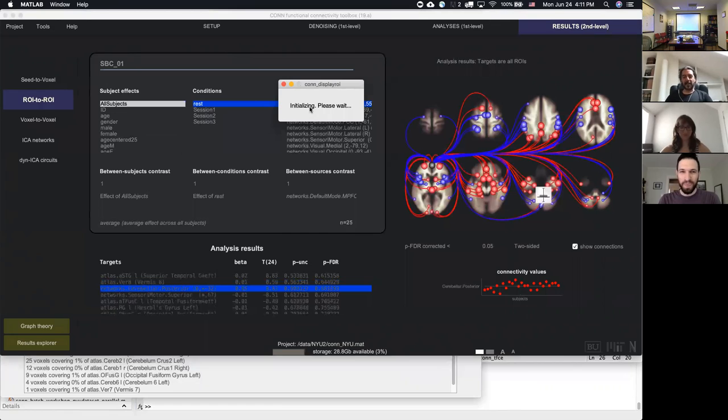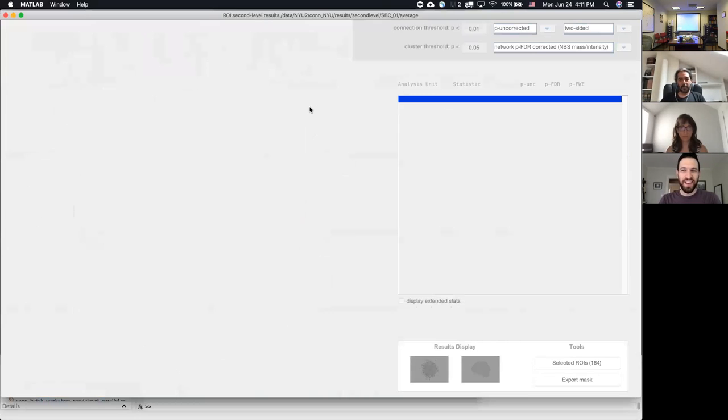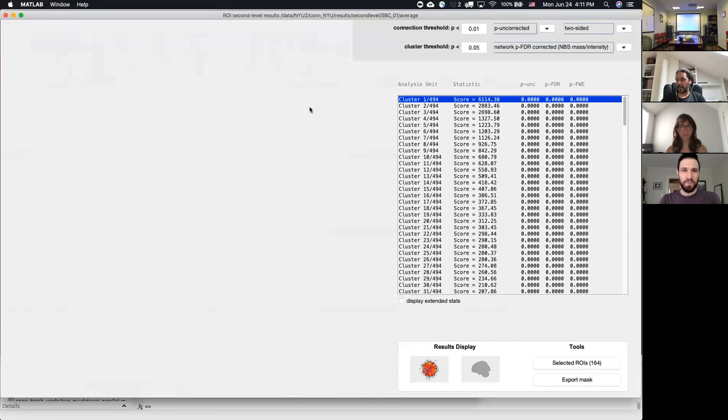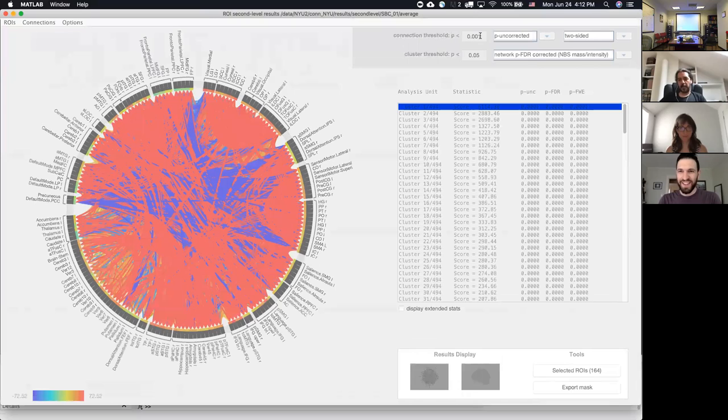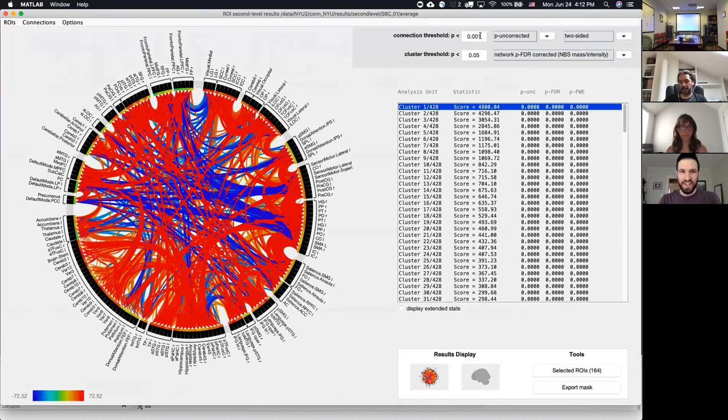Right. Now, this is only because I've been playing with the randomization procedure, whether to square values or not, because I was working with threshold-free cluster enhancement. That has one particular, pretty cool way of combining the extent and the strength of the results. They suggest that you should be looking at the square of the T statistics and the square root of the cluster sizes, because that combination appeared to be more significant.